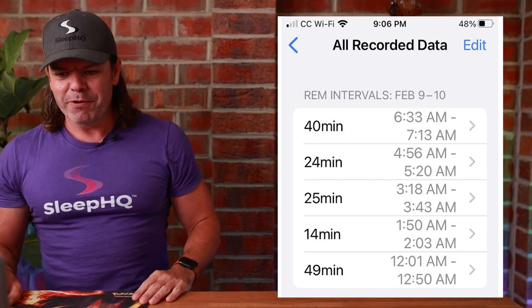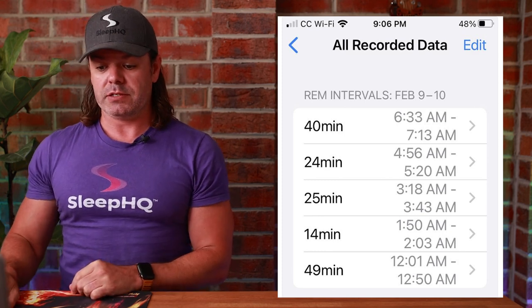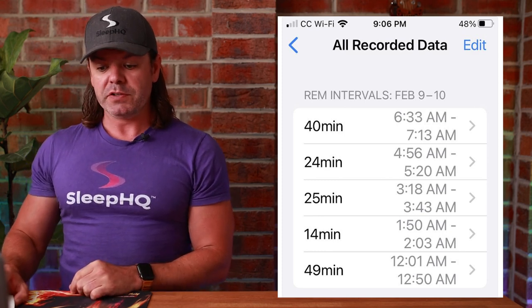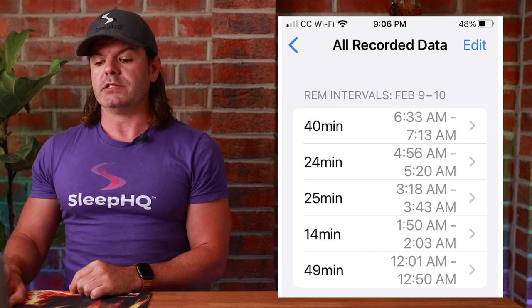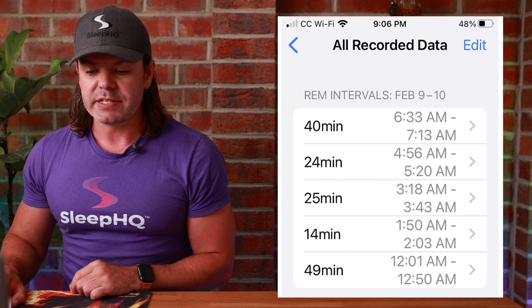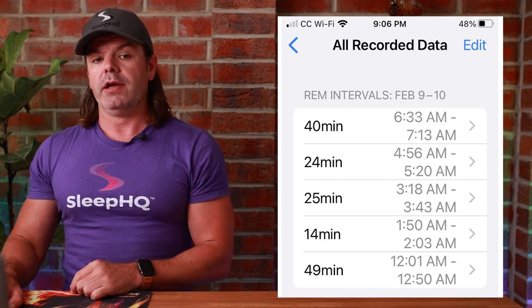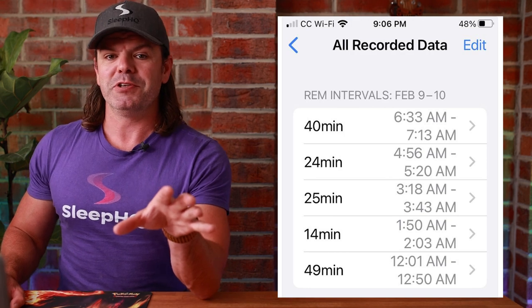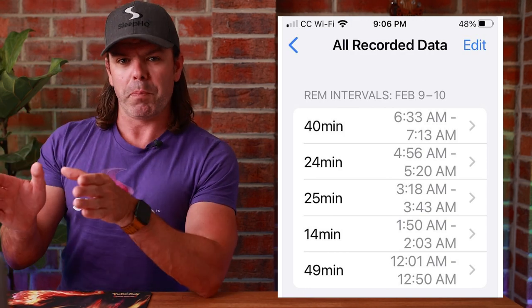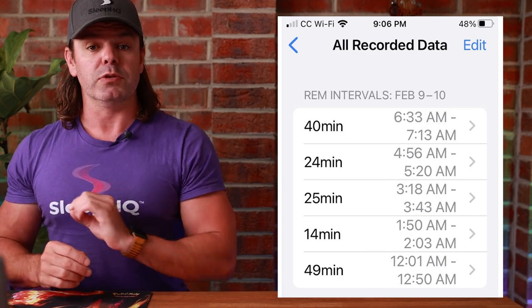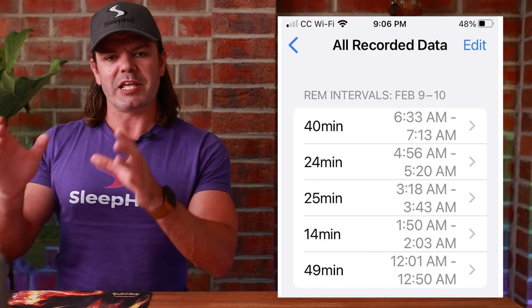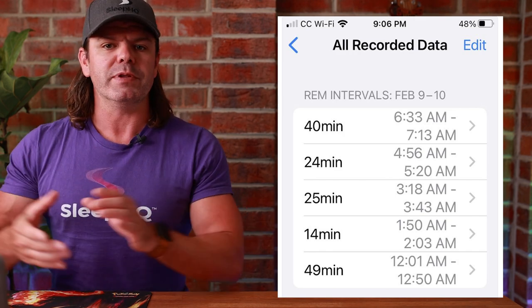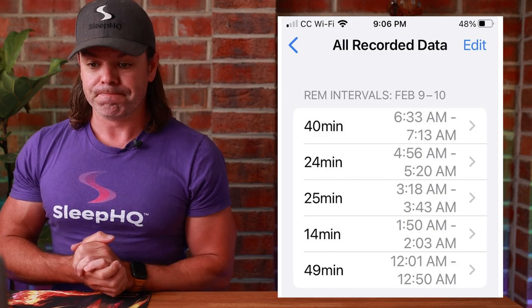So here are the REM intervals for Feb 9th to 10th. So it's recent data. The first interval, 49 minutes, running from 12 o'clock midnight to 12:50. Second one, 14 minutes, running from 1:50 to 2:03 and so on. Now we're gonna pull up the Sleep HQ data. I've reordered the charts and we're gonna look for some patterns. And these are some things you guys can look for as well. If you're interested and you wanna see in your Sleep HQ charts when you're dreaming and what happens to your therapy when you're in REM sleep.